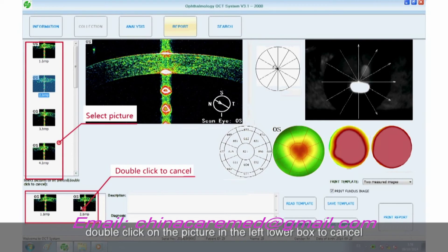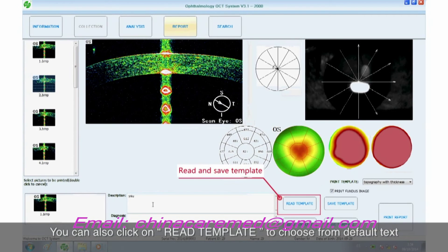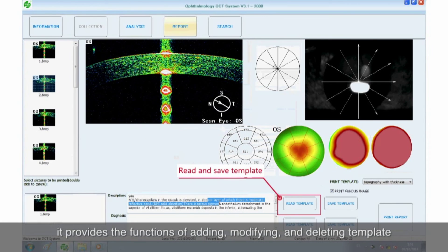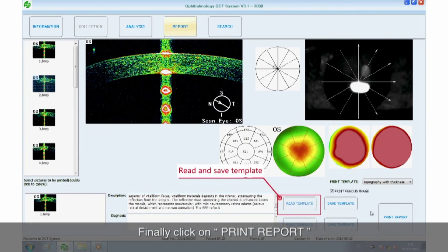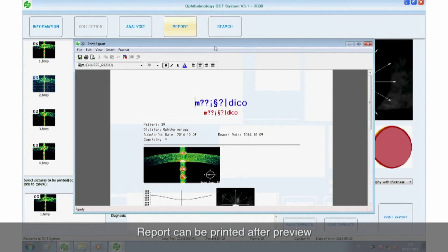In description box, words can be input directly. You can also click on read template to choose from default text. Meanwhile, it provides the functions of adding, modifying and deleting template. Finally, click on print report. Report can be printed after preview. Thank you.